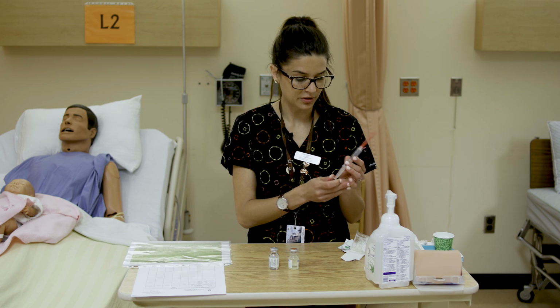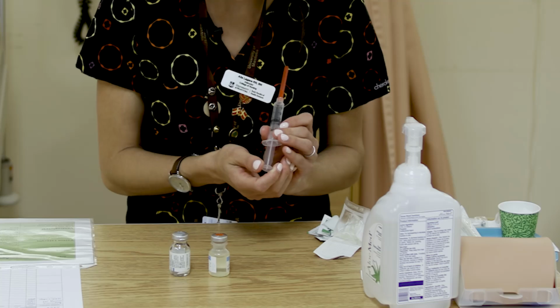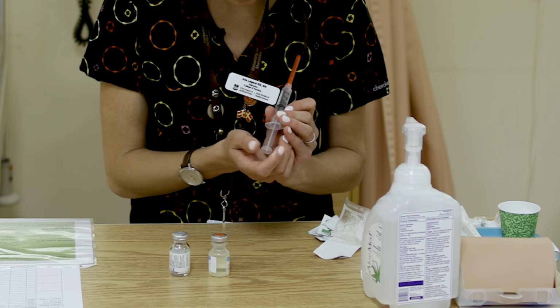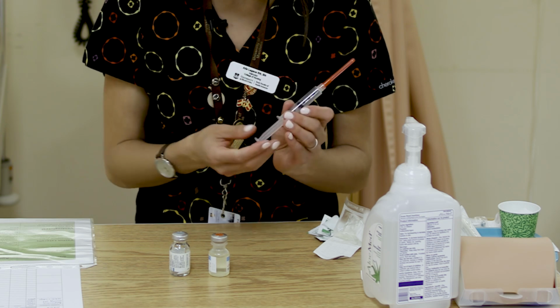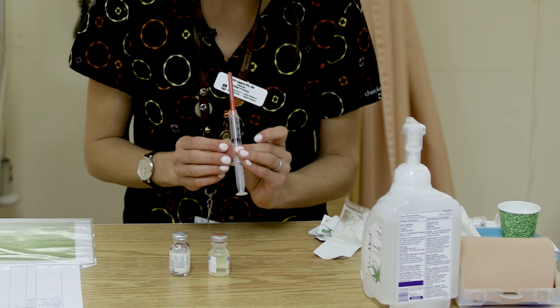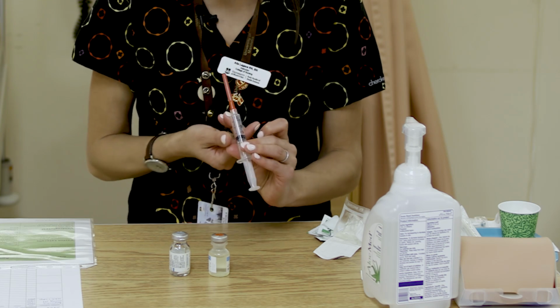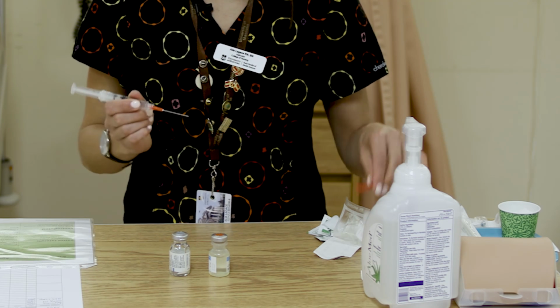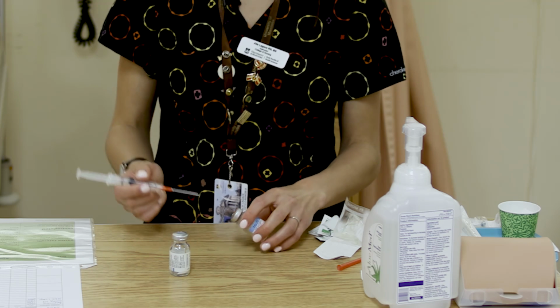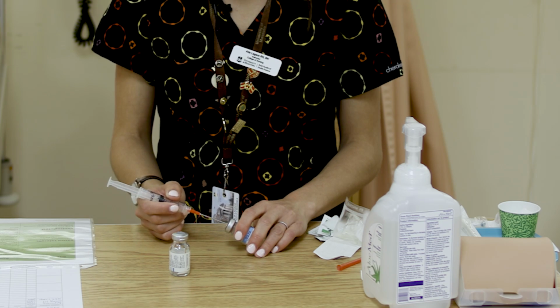And we're going to go, each line is worth 0.2, so 3.2, 3.4. If we go between the 3.4 and 3.6, we get that 3.5. So you want to go right between there to get our 3.5. And now we're going to uncap our blunt fill needle. It's not a filter because these are not amps, they're vials.